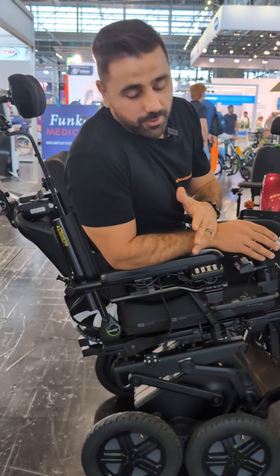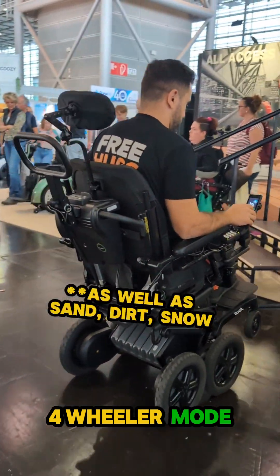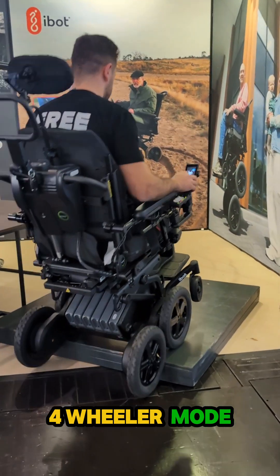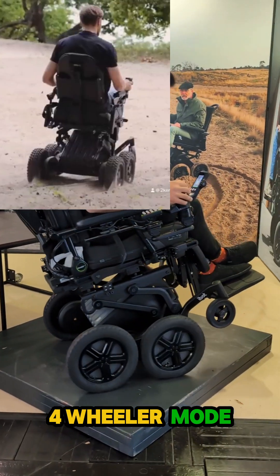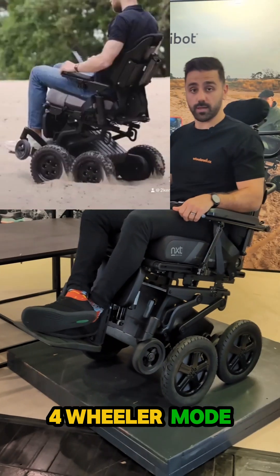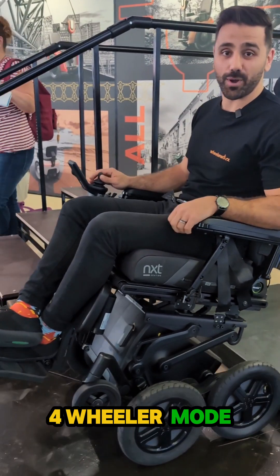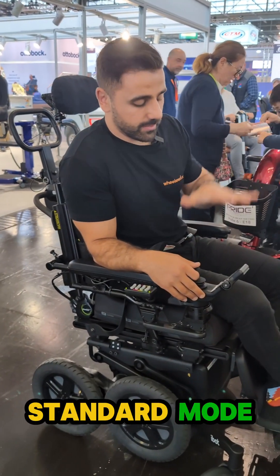We have curb climbing mode which allows you to climb curbs. I want to come in nice and close, just make contact with it, and then full power — climbing curbs — and I can turn on the spot. Then to go down I want to come down just gently, let the chair catch, and away we go.